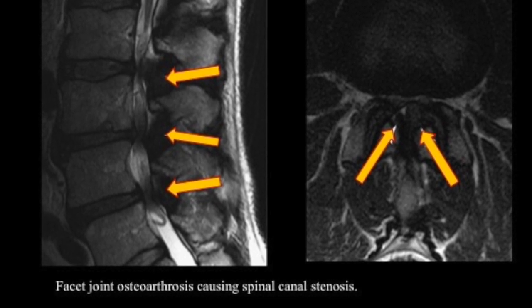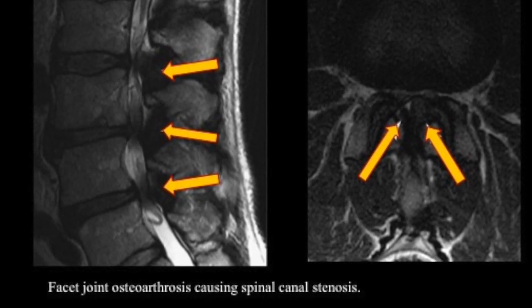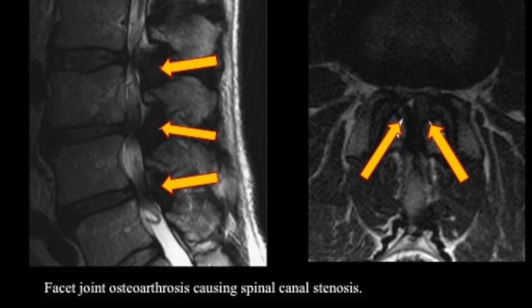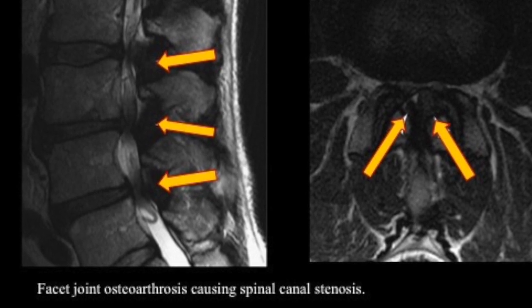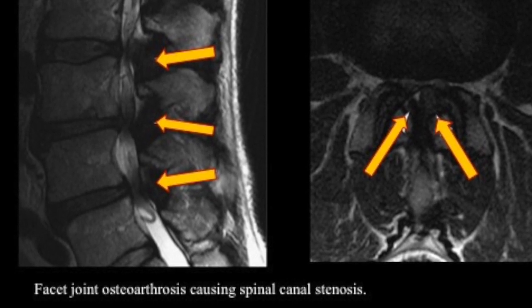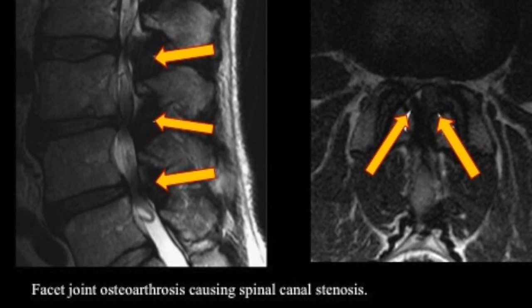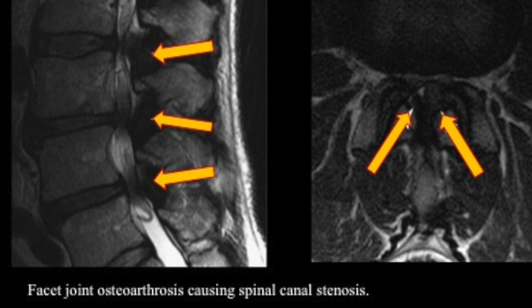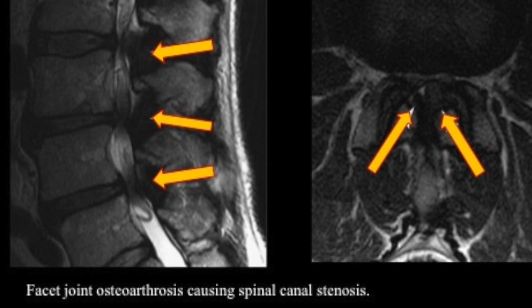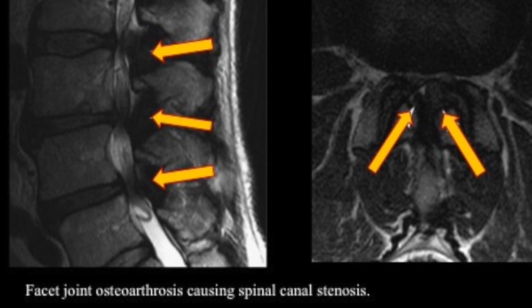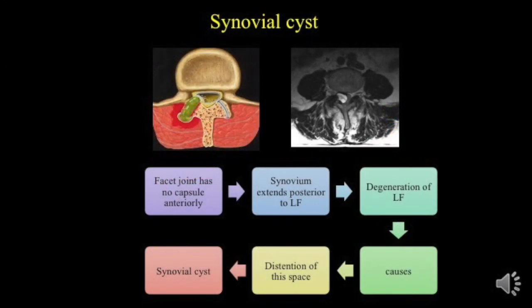An example demonstrates facet joint osteoarthrosis causing spinal canal stenosis with ligamentum flavum thickening, described as secondary spinal canal stenosis due to osteoarthrosis at the facet joints and ligamentum flavum. We then come to a very commonly seen mass effect — the synovial cyst.